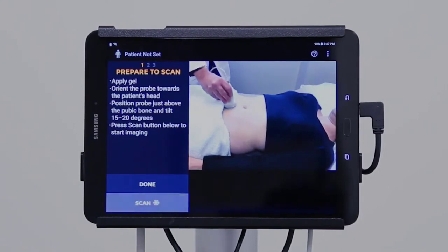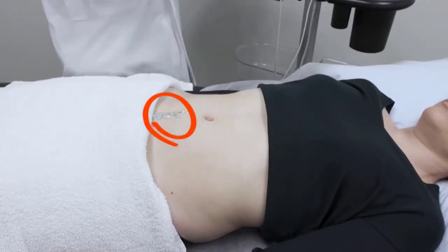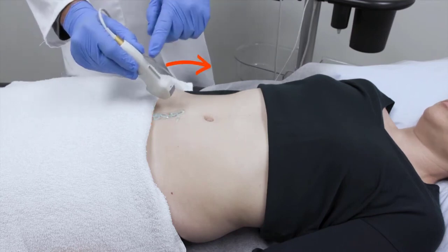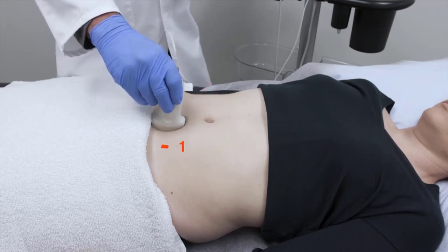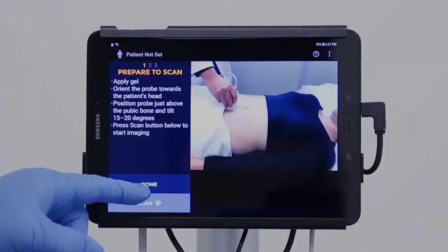Lay the patient as flat as can be tolerated. If necessary, palpate the patient's pubic bone. Apply the gel and position the probe about an inch above the pubic bone with the orientation marker facing towards the patient's head. Apply pressure firmly. Tilt the portion of the probe in contact with the patient 15 to 20 degrees towards the feet. Then select scan.